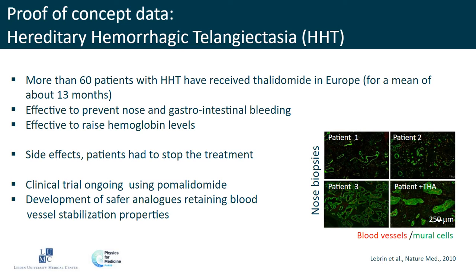Many publications have also reported that thalidomide and its analogs have benefit to treat neurological disease in preclinical models. Clinical implementation of safer analogs could therefore be a promising approach. However, their implementation in clinical practice is limited by the lack of early markers of disease progression and a clear mechanism of action. This is our main objective, focusing on the vessel angle. For this, we are evaluating whether ultrasound imaging could provide useful modalities to study cerebral small-sized blood vessel disease and drug action, focusing on ultrasound localization microscopy and functional ultrasound imaging.